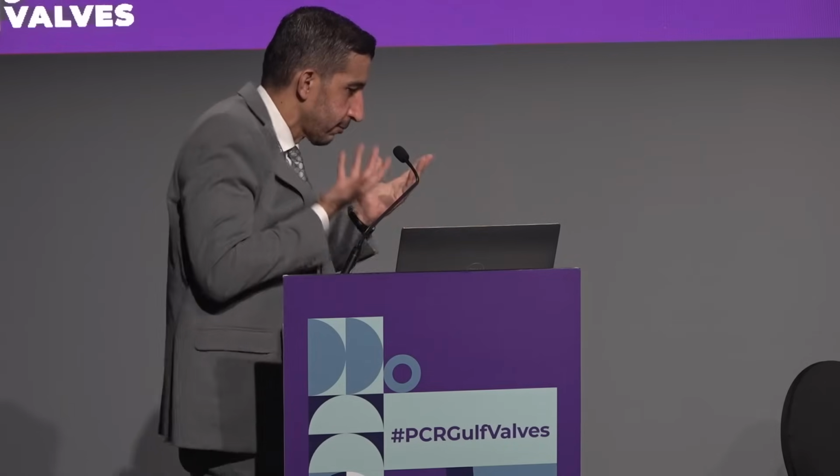Mahmoud, do you have to comment? Actually, since we have some time, I was going to ask Hatem a question on his case, because I'm curious what you did. You had great commissural alignment on your case. For Navitor, we usually can adjust the commissural alignment in the descending aorta. How did you do it? Did it just go right to that right location, or how did you adjust when you were delivering? Did you go at standard where you keep it at 12 o'clock, or did you have to do anything? Because it looked ideal, but did you do anything to adjust it?